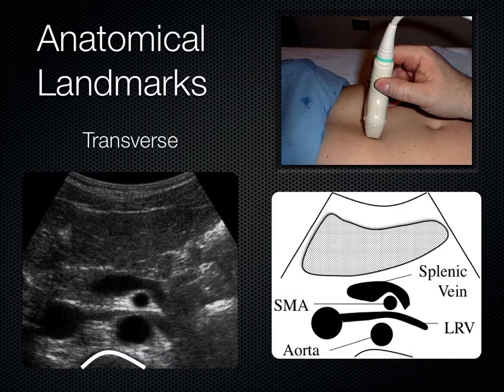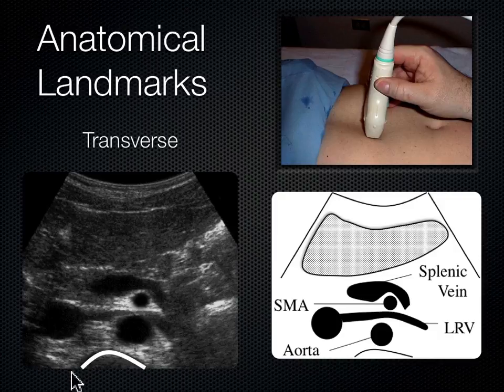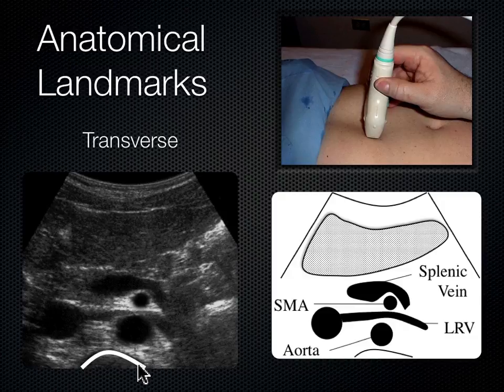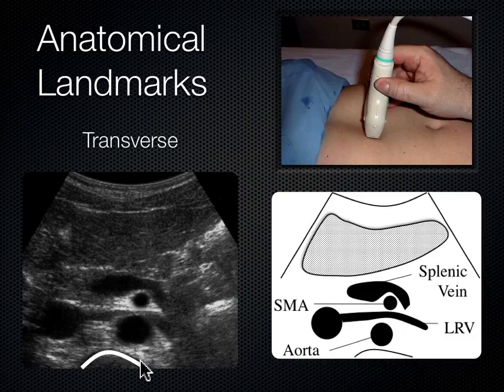Now we turn the probe into a transverse plane — from parasagittal right, we aim the indicator to the patient's right for a cross-section of the body. The first landmark is the spine shadow, where sound encounters the spine, can't penetrate further, and bounces back up toward the probe. Going from posterior to anterior, the spine shadow is structure number one.